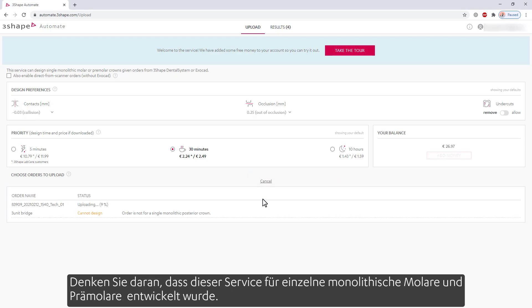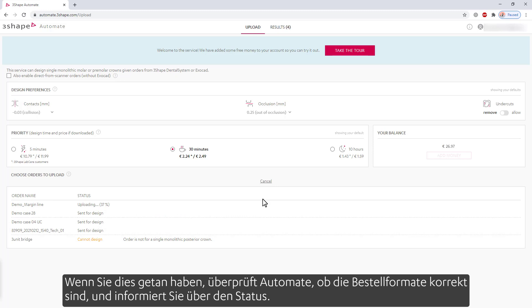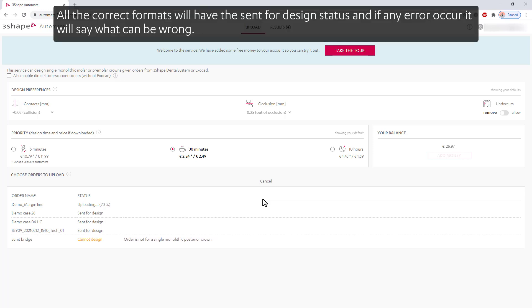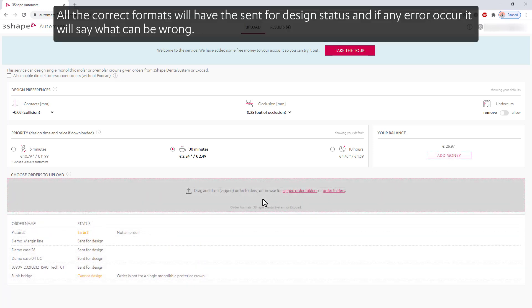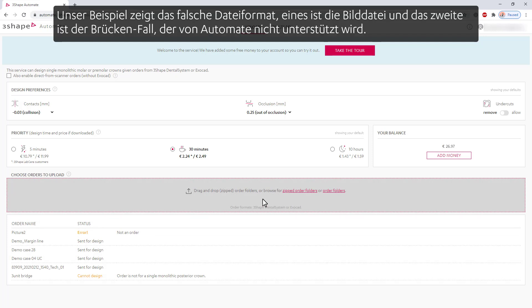Keep in mind that this service can design for single monolithic molar and premolar crowns. When you've done that, Automate will check if the order formats are correct and will inform you about the status. All the correct formats will have the 'sent for design' status, and if any errors occur, it will say what can be wrong. Our example shows the incorrect file format: one is a picture file, and the second is a bridge case, which are not supported by Automate.